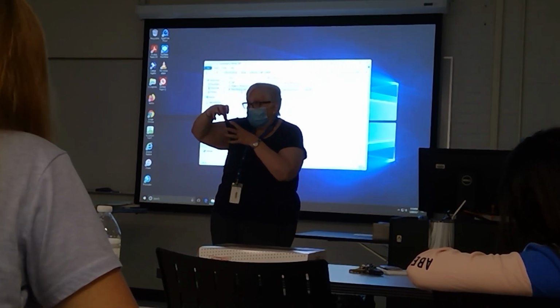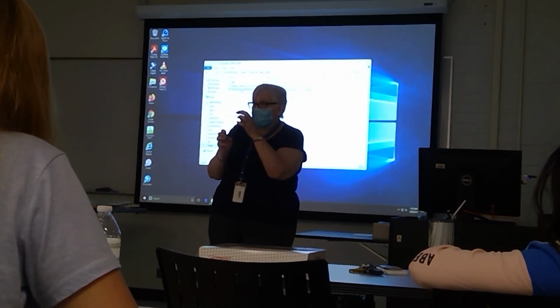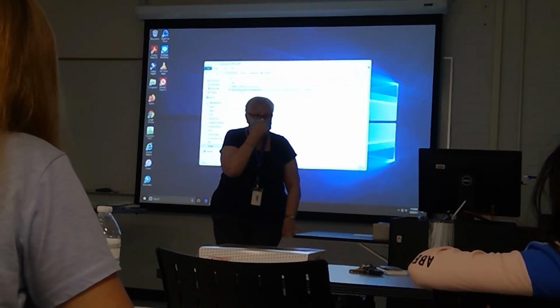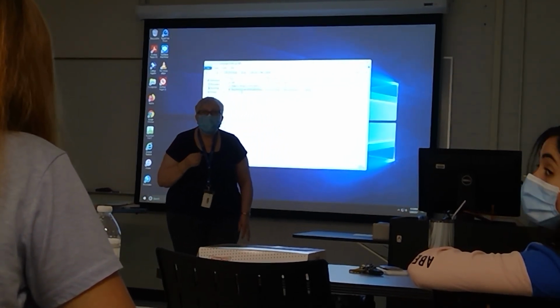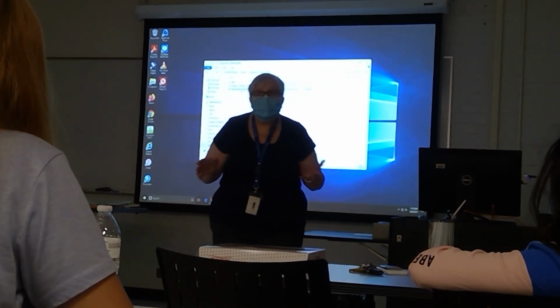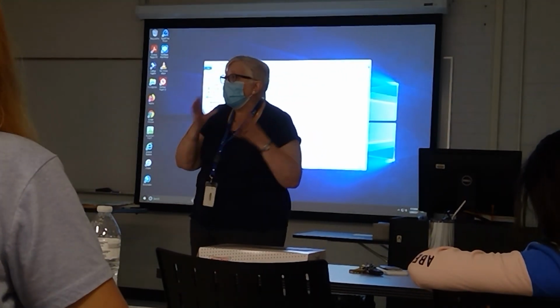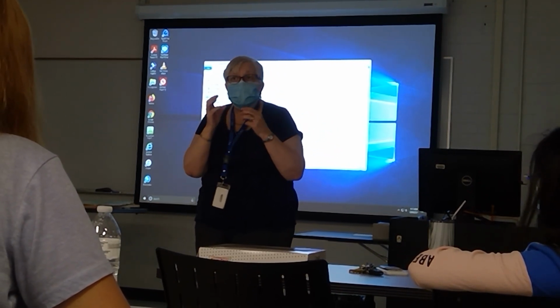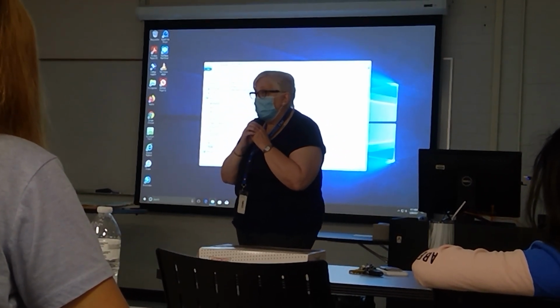They'll do one field from one end and then another field from another position. That is called static IMRT. That's how all of mine are. My machine doesn't even have the arc. That's fine. So IMRT does not equal arcs. IMRT is the way it's planned.